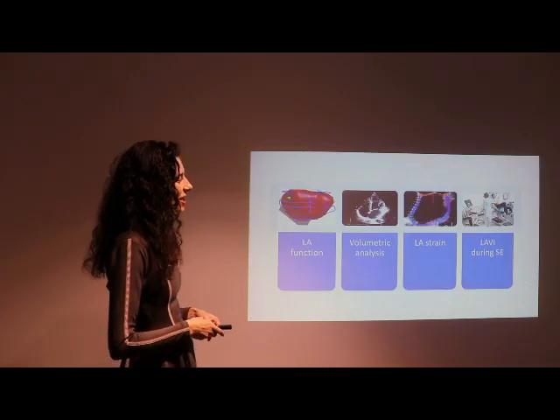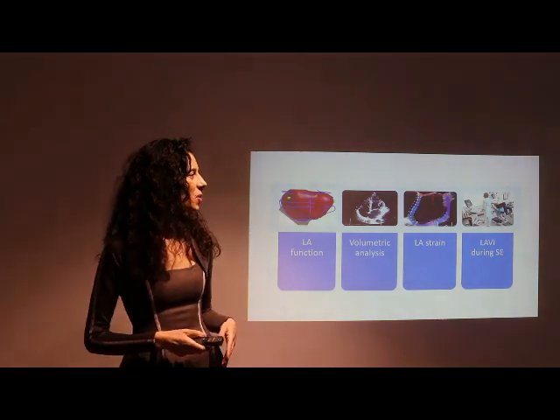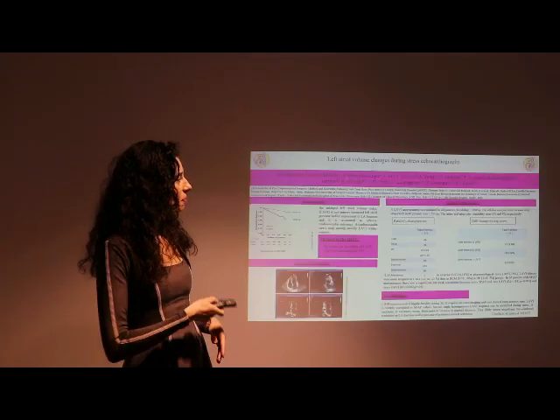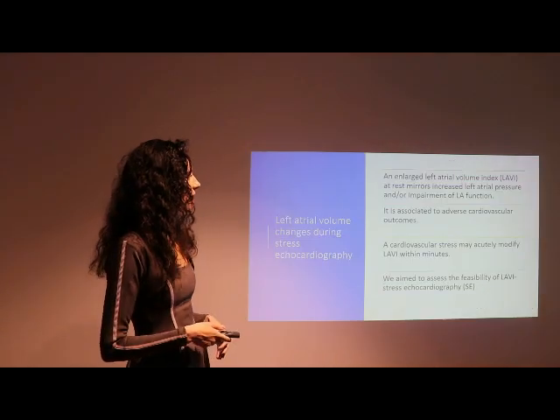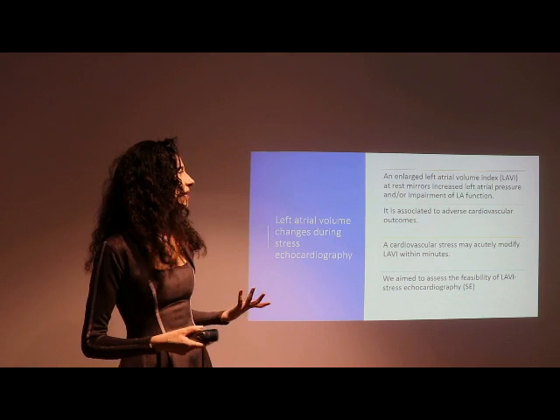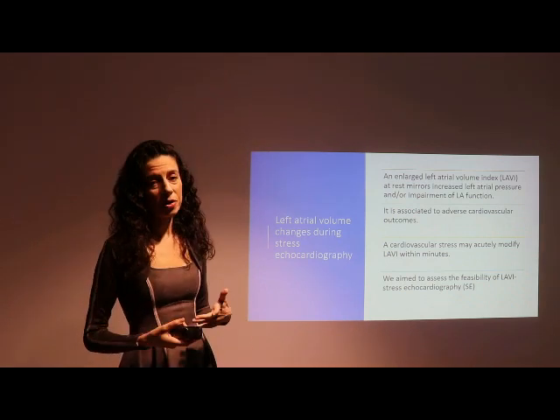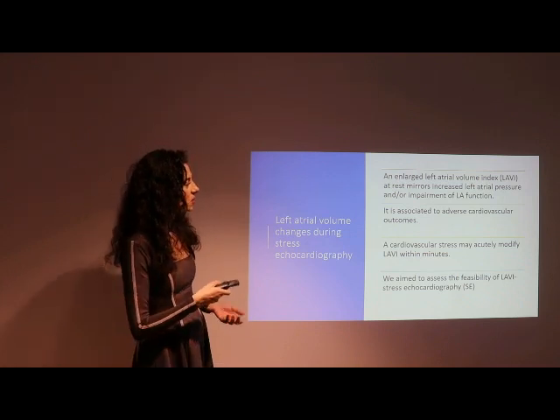And last but not least, I would like to share with you our initial experience with measuring left atrial volume index, or LAVI, during stress echo. So this is a poster that we presented at the last year EuroEcho Imaging Congress, and we have the following reasoning: that an enlarged LAVI at rest mirrors increased left atrial pressure and or impairment of left atrial function, and it is associated with adverse cardiovascular outcomes.